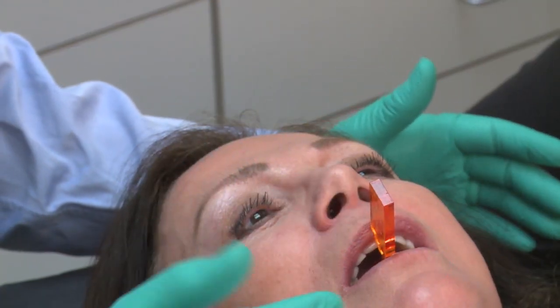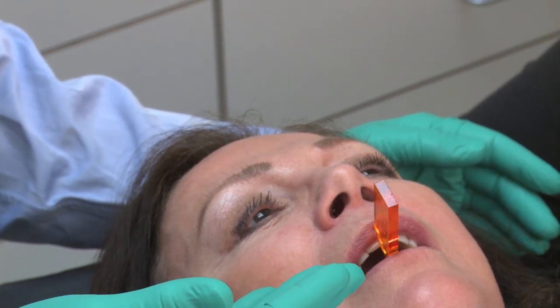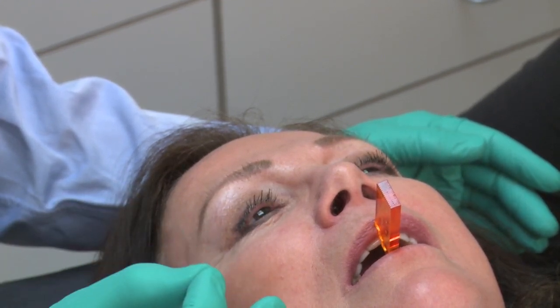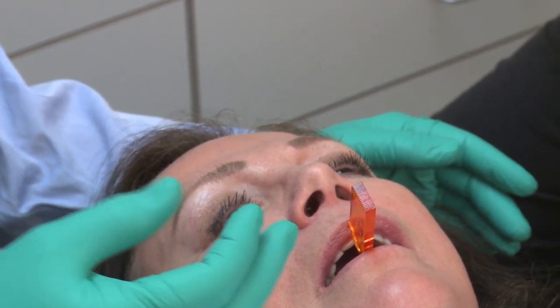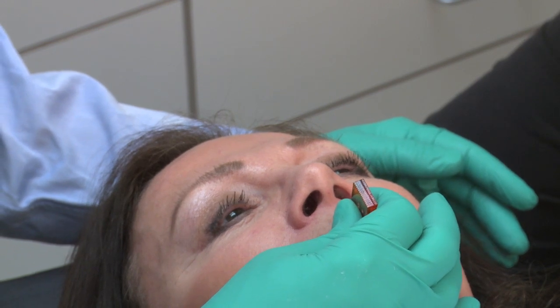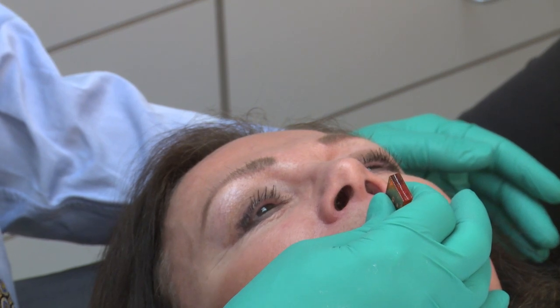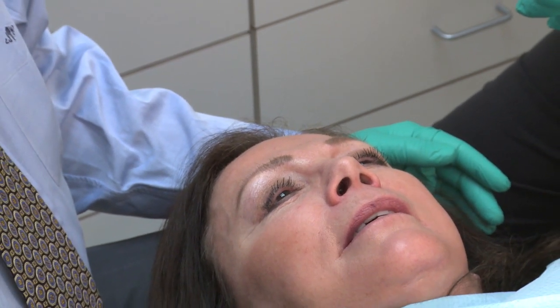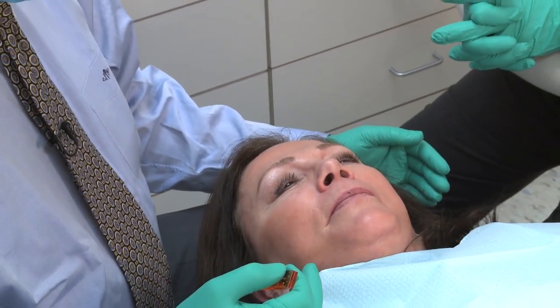Now for video purposes, I'm removing my hand so that you can see the snore screener in place. And then we'll have Kim snore. Don't ever let go of the snore screener while the patient is snoring, because the last thing you want to have happen is have them aspirate the piece. Go ahead and snore. What do you think, Tammy? I heard more air. Try it once more, Kim. Excellent, and open. Kim, did you feel like you got more air in? Yes. Okay, and that was comfortable? Very comfortable. Didn't hurt your jaw joint at all? No, not at all. Okay.